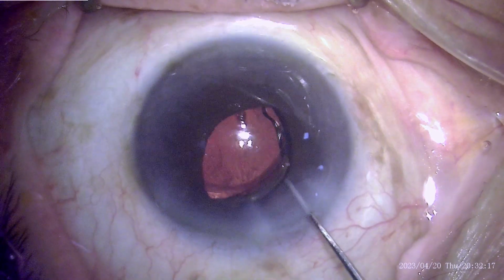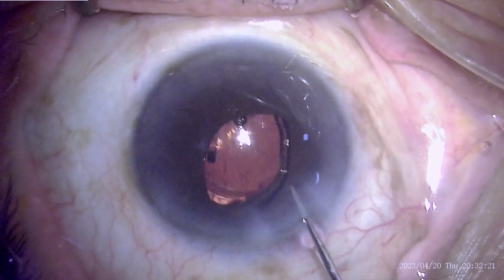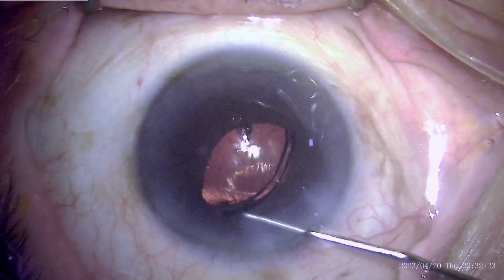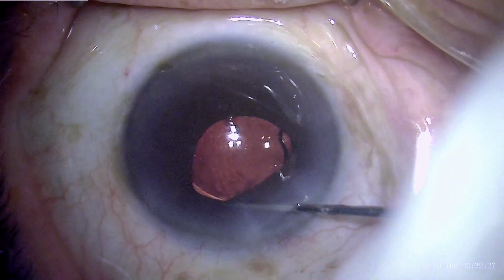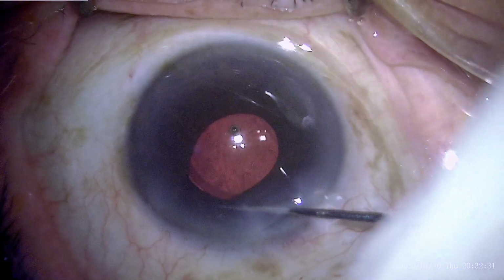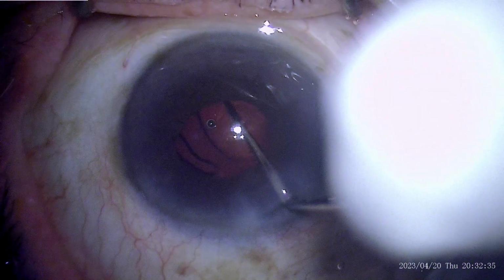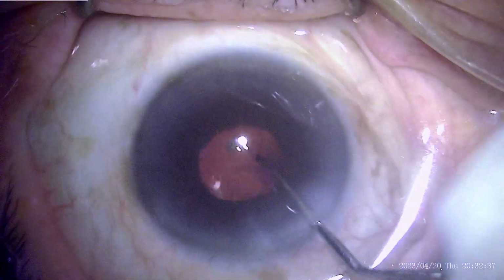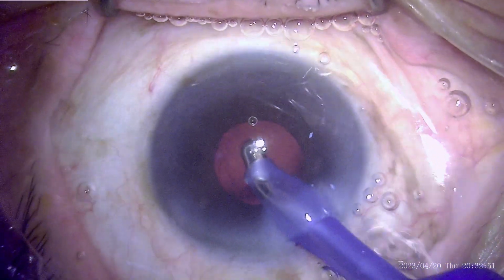Once the IOL has gone inside, it is time to dial the IOL because the leading haptic is settled in the bag and the trailing haptic can be simply dialed using a dialer. These are important steps so that you have an IOL in the bag, and this has to be confirmed because any IOL which is not in the bag can be a future cause for irritation and uveitis.